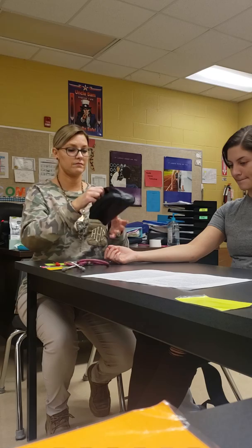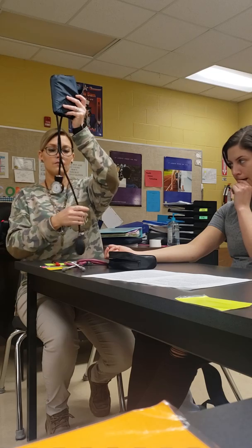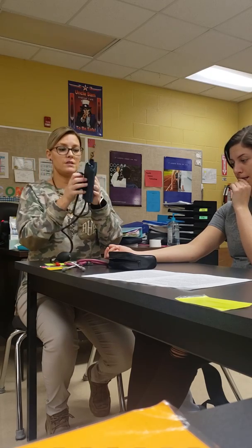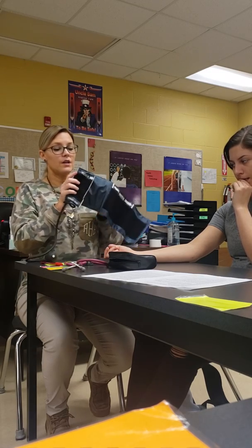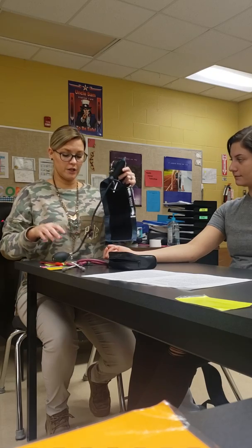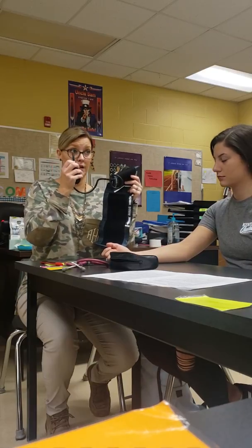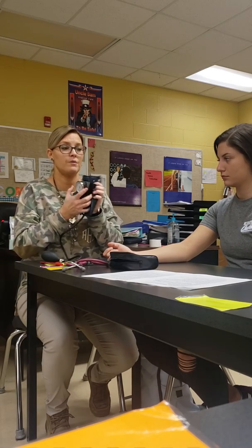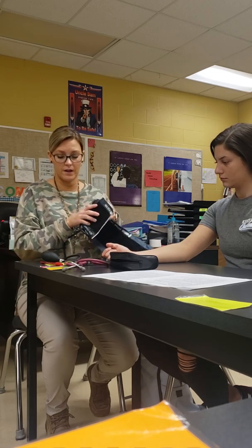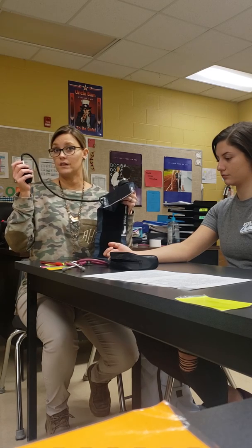Squeeze the cuff to expel any remaining air, and turn the valve clockwise on the bulb to close it. Okay, when you guys put these up, make sure you clip this back on the blood pressure cuff before you put them up and before you take them off so it doesn't bust. So I need to make sure that there's no extra air in the blood pressure cuff. But in order to do that, I actually need to turn it all the way to the left or counterclockwise first and make sure that it's open. Otherwise, I'm going to squeeze the cuff, and if there's air still in it, it's not going to matter because the valve isn't open. So I've squeezed the cuff. There's no extra air. So now I'm going to turn it clockwise to the right until it meets resistance and stops.